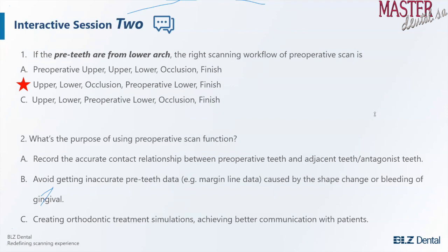Please write down your answers. What's the purpose of preoperative scan? A, B, really? There's only one right choice, okay? Okay, there's only one right choice. B is for scan data locking. Okay, you are quite correct.